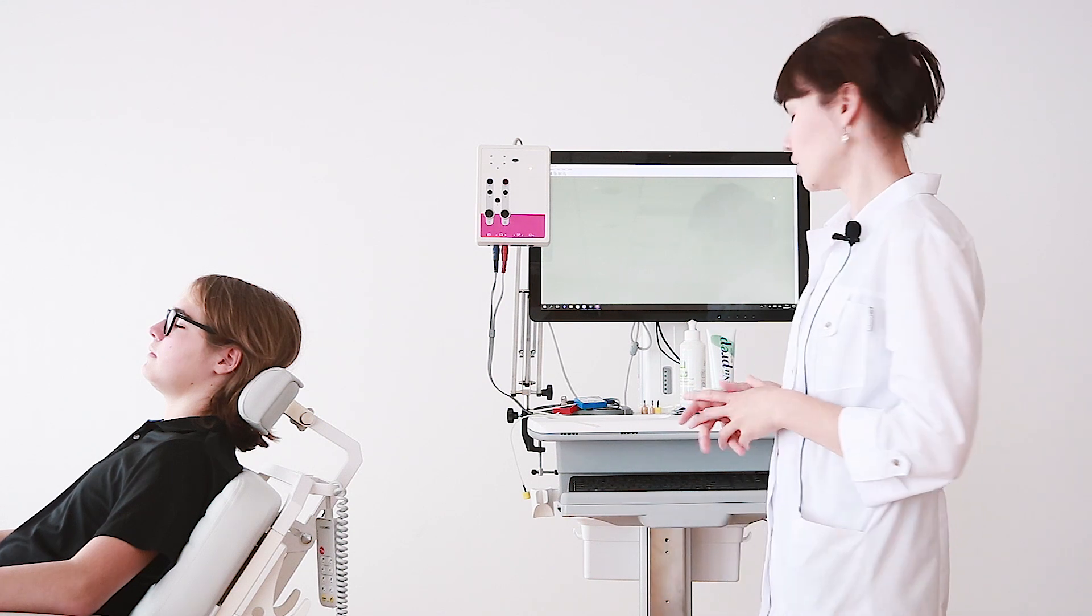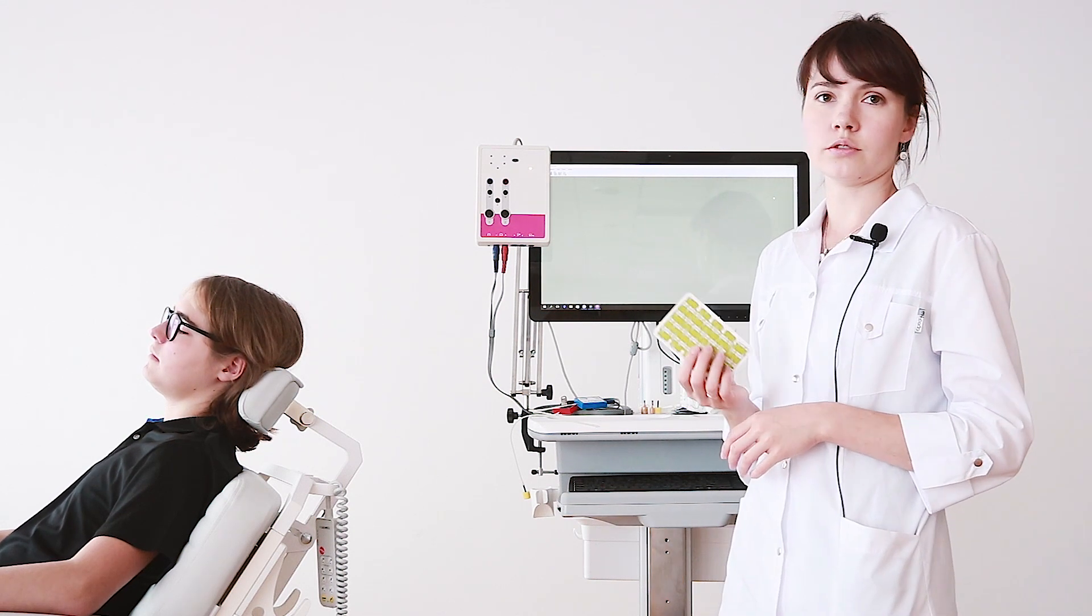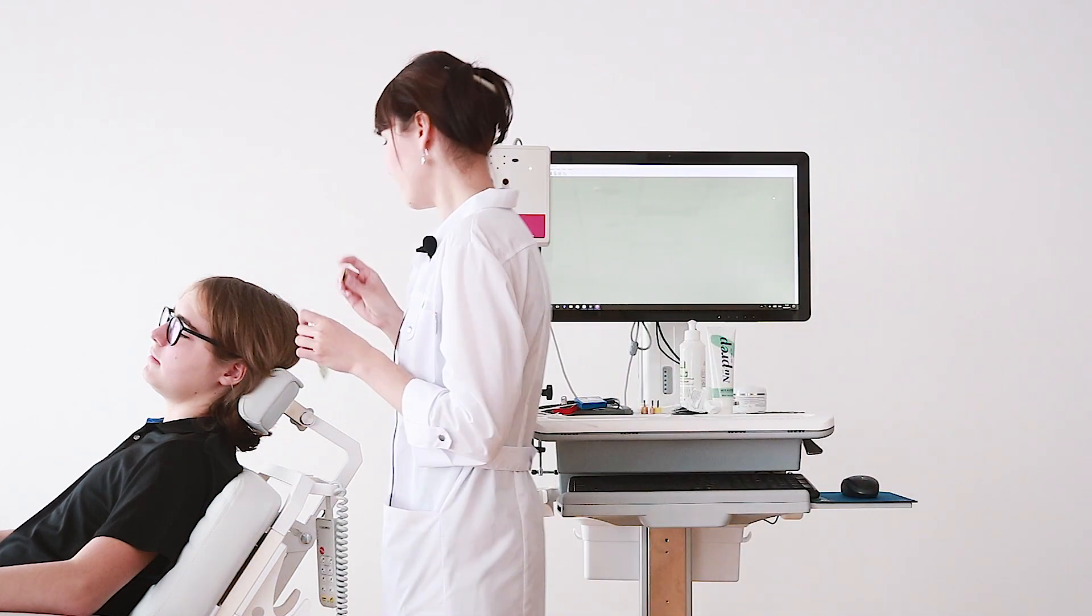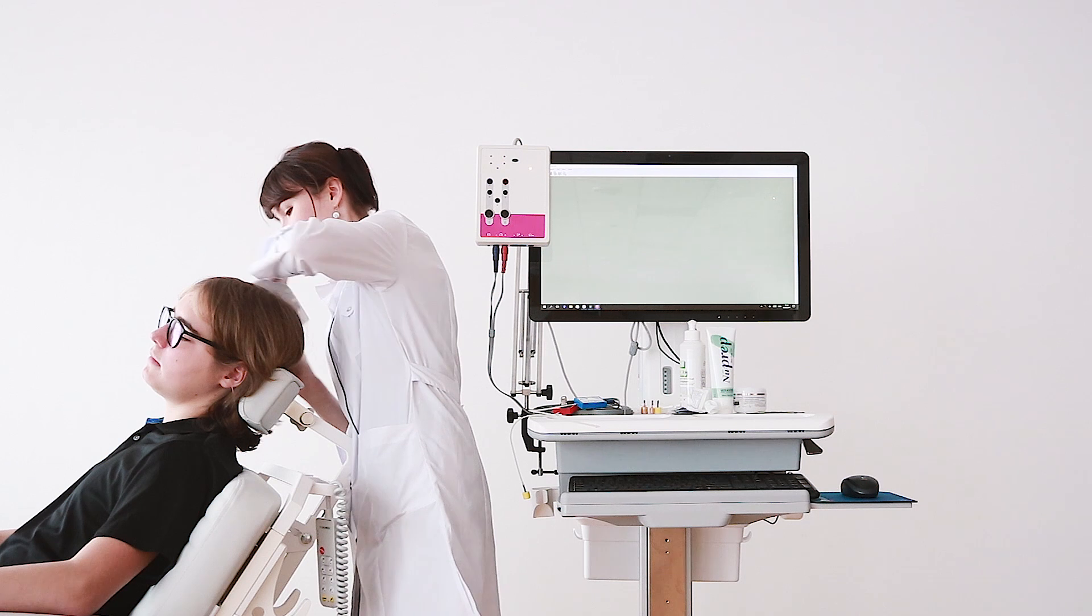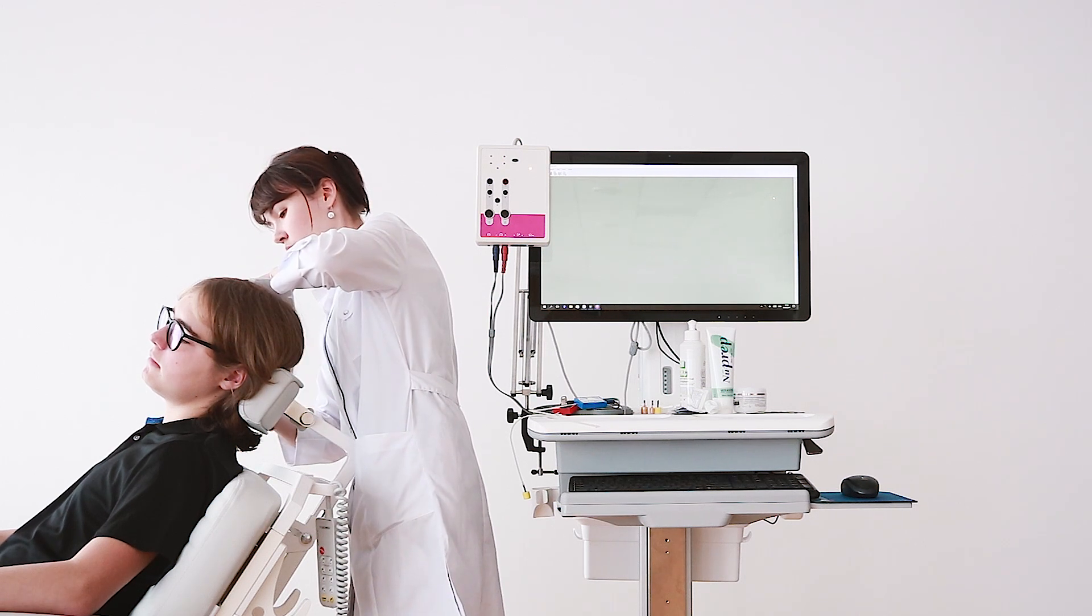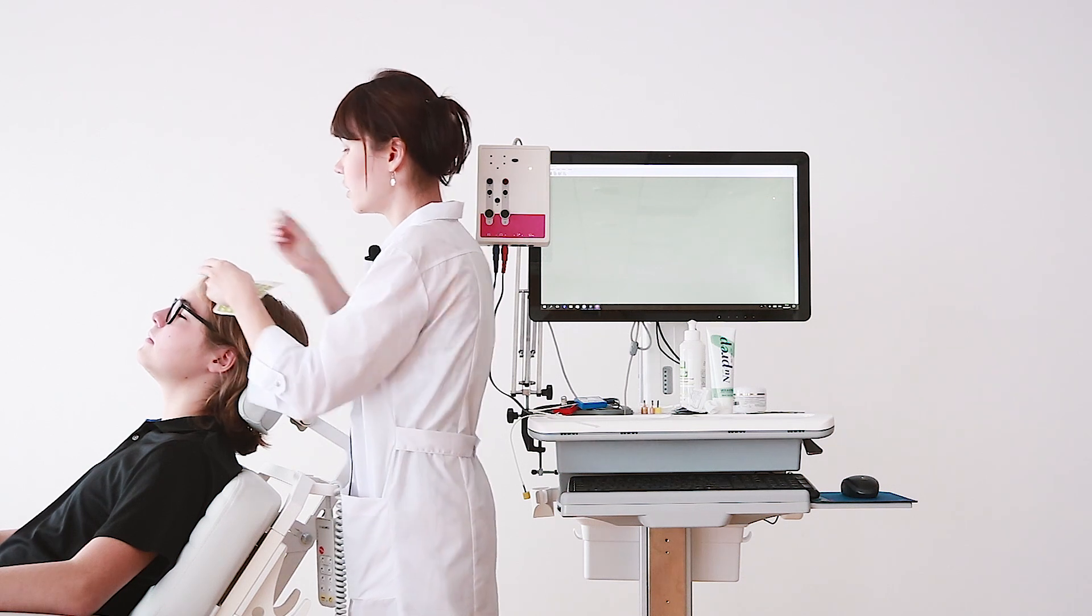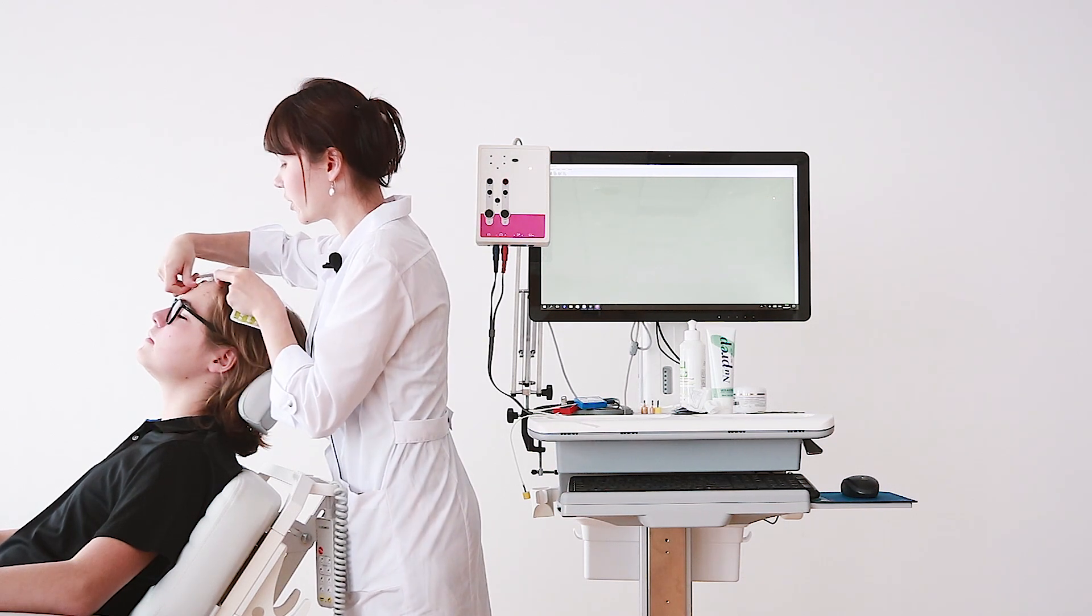Now we can position the reference and the ground electrodes. Today we will use single-use hydrogel electrodes. We put it on the skin behind the right mastoid. The reference and the ground on the forehead.